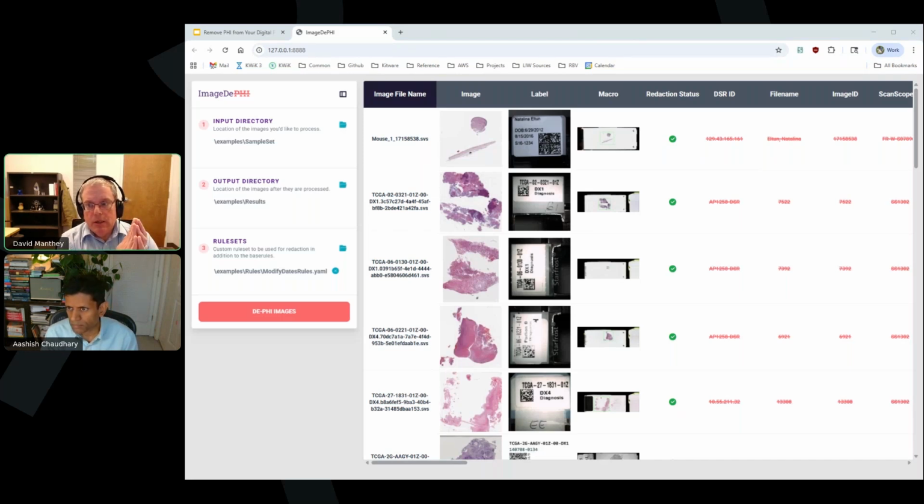Basically, for opening and reading images, we are using Python libraries depending on the image format. So under the hood, there's some Python code here. We're using TIFF tools for reading TIFF files and pydicom for DICOM files. We are not actually decompressing images. We read a specific portion of it so we can decode it to show it, but we never recompress the image. We are just taking the bits of the image and moving them to guarantee that we're not introducing any artifacts.